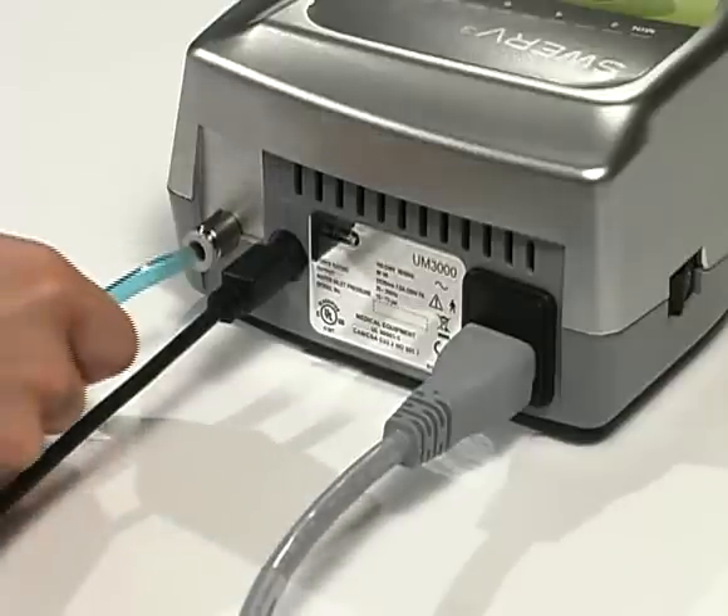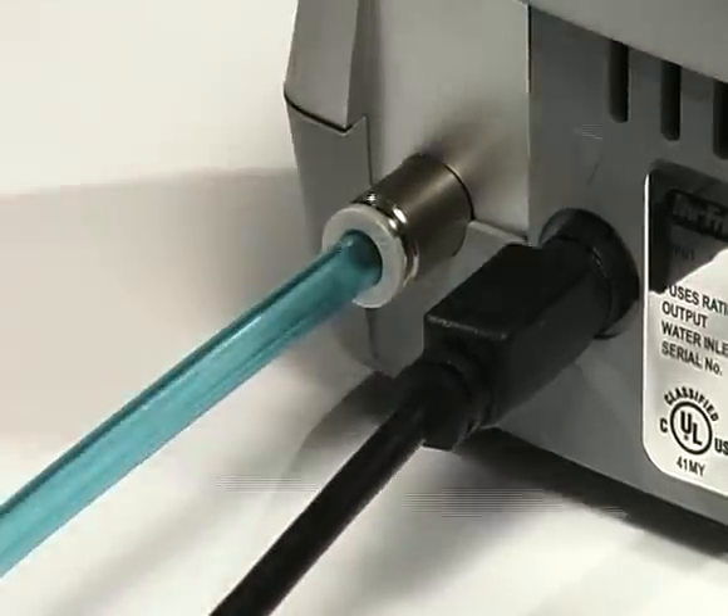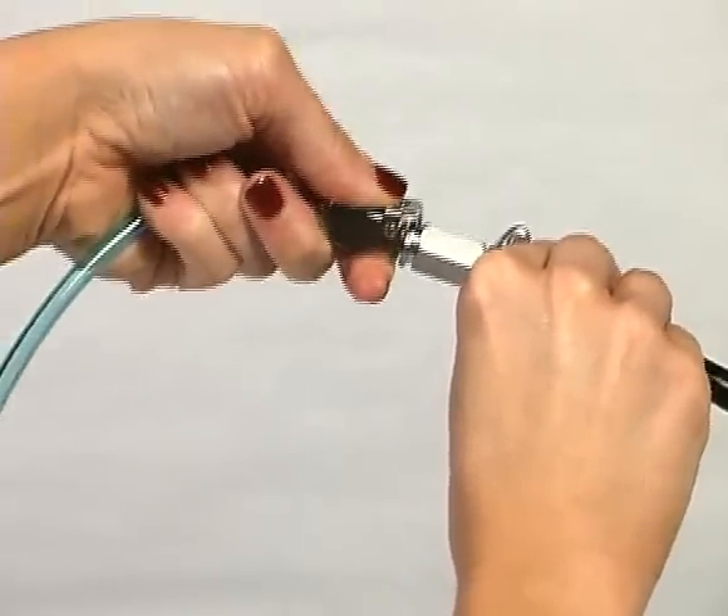Connect the filter side of the water tube by inserting the tube deep into the water connector on the control unit. Connect the other end of the water tube with quick connect to your operatory water source.